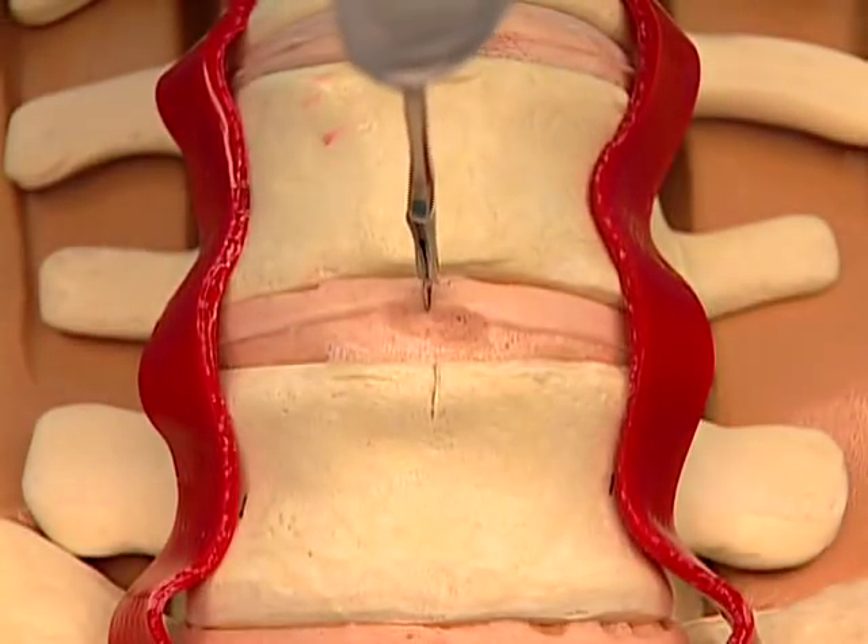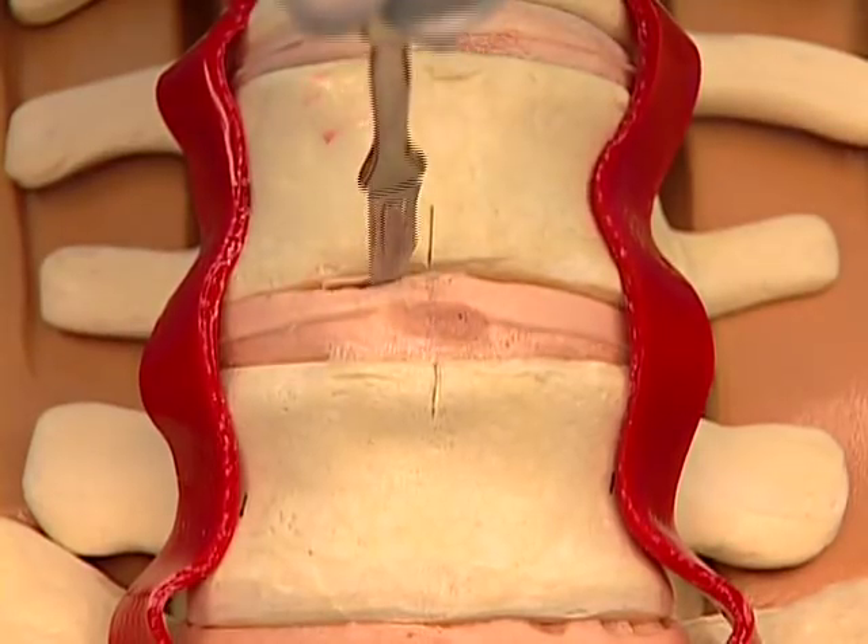Create an annulotomy centered on the midline and wide enough to accommodate the ProDisc-L implant.